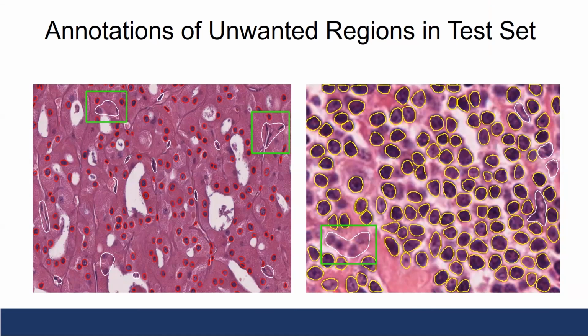Yeah, I see what you're saying there. I would also add to that, these annotations were done by engineers like us in collaboration with pathologists. So we understood 4 classes, and then we also tried to do fibroblasts and other things, which were really difficult for us. So we thought, okay, let's focus on those classes which we understand and which we can phenotypically see on a slide and annotate those. And then we can move on. There is one data set that did fibroblasts and other types of cells that are important, to capture the field effects and other things. But in this case, we just focused on 4 classes.